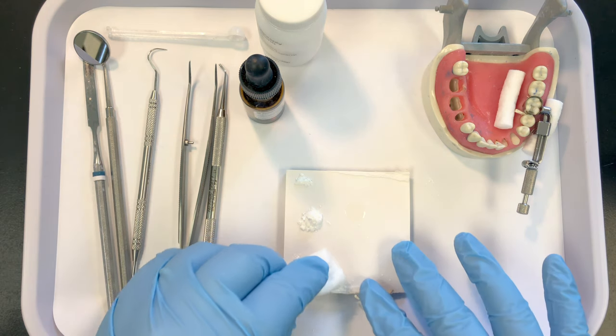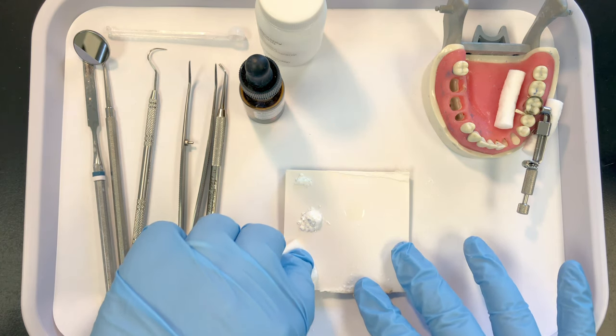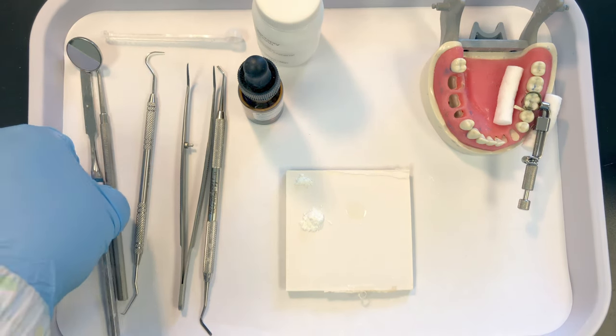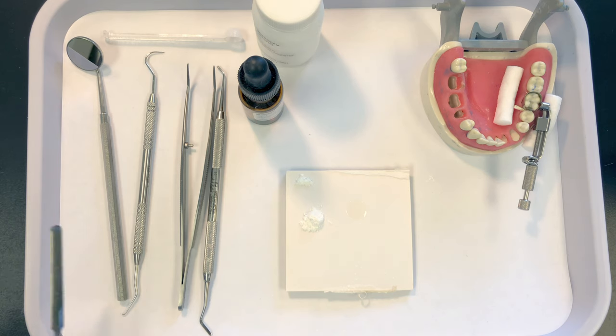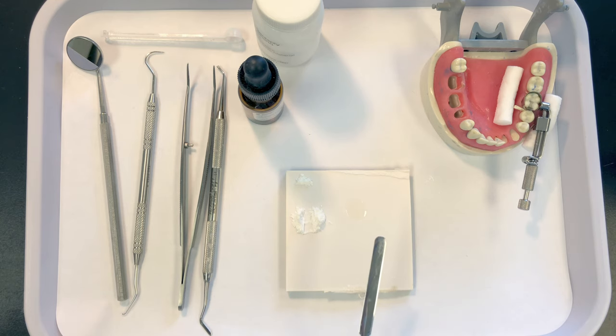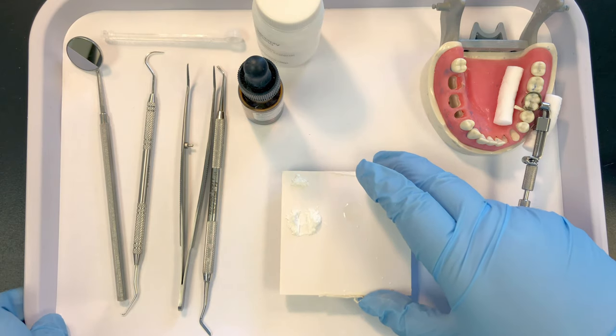Since I don't need this extra liquid, I'm going to wipe it away. Your mixing time — you have a full minute to mix and we mix in increments. I'll take my powder and separate it. Mix half of your powder into the liquid for 15 seconds, then keep adding in two or three increments, mixing each one for 15 seconds until it's the proper consistency.